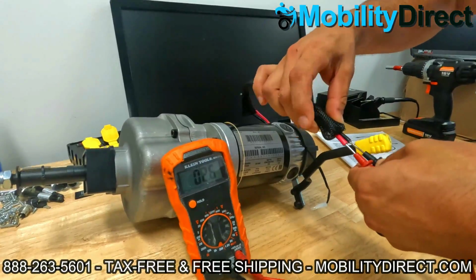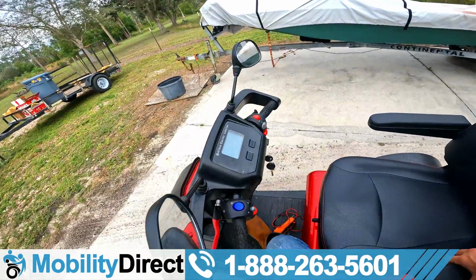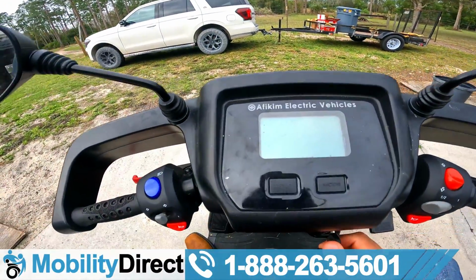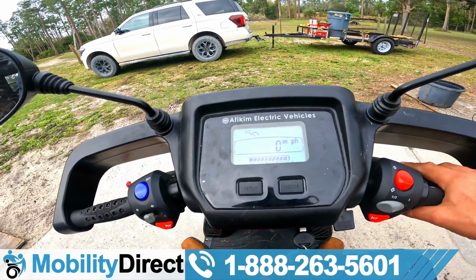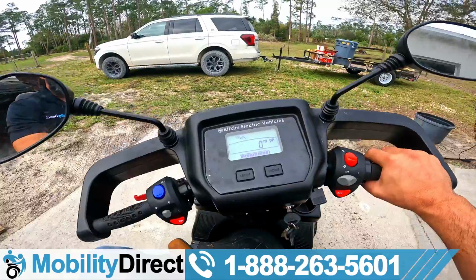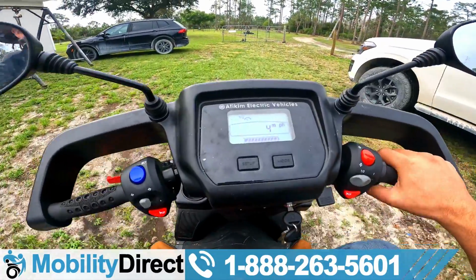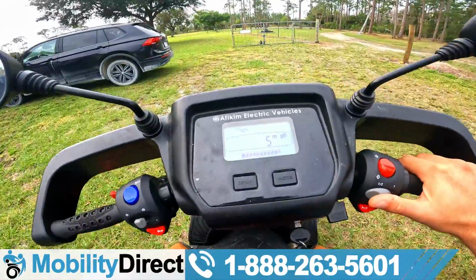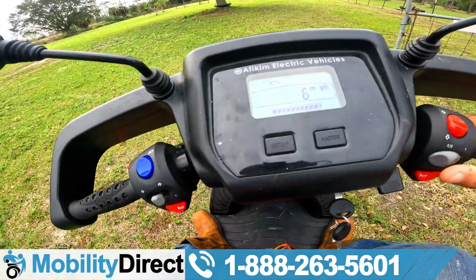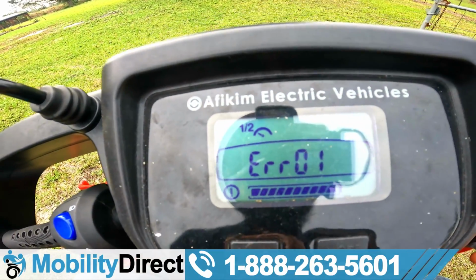So let's go ahead and dive into things. So again, this is the S4. I'm gonna get on the scooter here and just show you the issue that we're having. So this mobility scooter has two 12-volt batteries like most mobility scooters. And the first thing you really wanna do if you get that error 1 code is make sure that your batteries aren't going bad. Now I'm just going normal pace here. I'm at half speed. I'm gonna switch. Oh, I didn't even need to switch to full speed. It just stopped on me suddenly. And there we go, error 1.